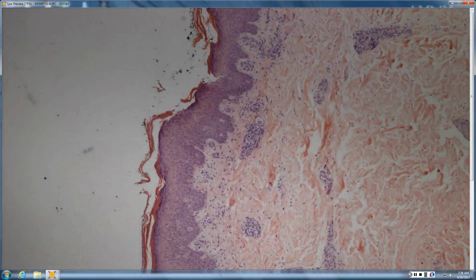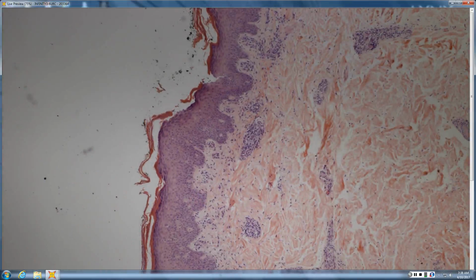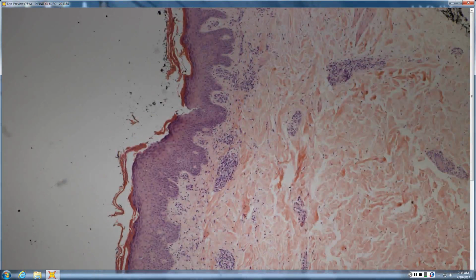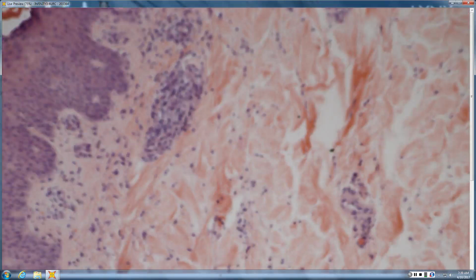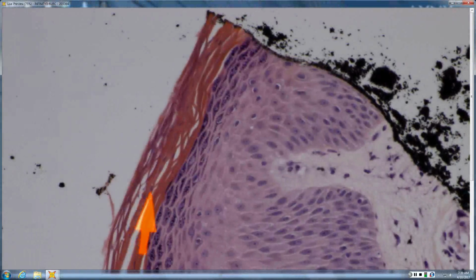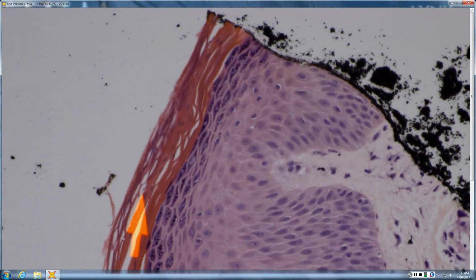So it looks like you have a sparse perivascular superficial infiltrate. Yeah. Is your stratum corneum uniform? Or is it basket weave above and compact below? Basket weave above and compact below. So tinea would be the first thing you'd want to rule out. And where would you look? Would you look in the basket weave above or the compact below? Compact? The other way around. Yeah. No, the compact. You're right. The compact below. The basket weave is the old normal stuff. So you look in the compact below, and if there are little clear circles like that or a little tinea like that, then you got it. Okay.